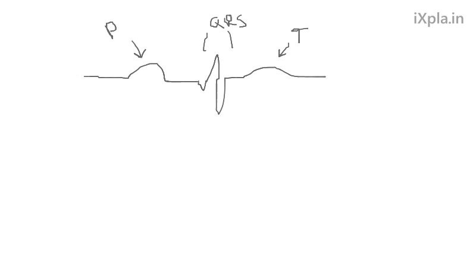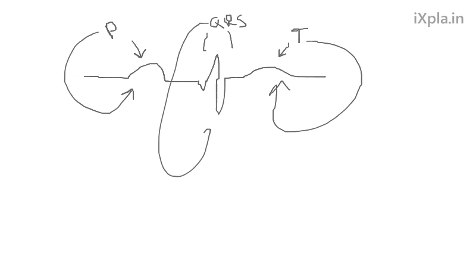Know what they identify. Like the P wave will be atrial depolarization. I'm not going to write it. T wave is ventricular repolarization. QRS is ventricular depolarization. Ventriculars are massive compared to the atrium. That's why the amplitude is so much larger in the QRS segment. T wave is the QRS segment recovering, repolarizing, and atrial repolarization is hidden in the QRS segment.